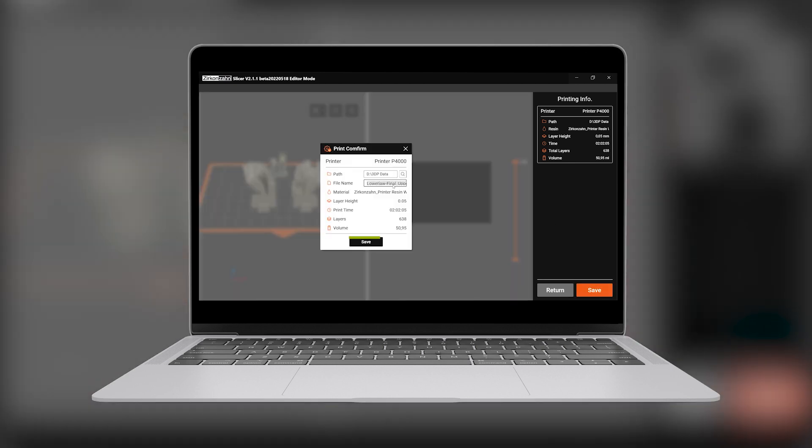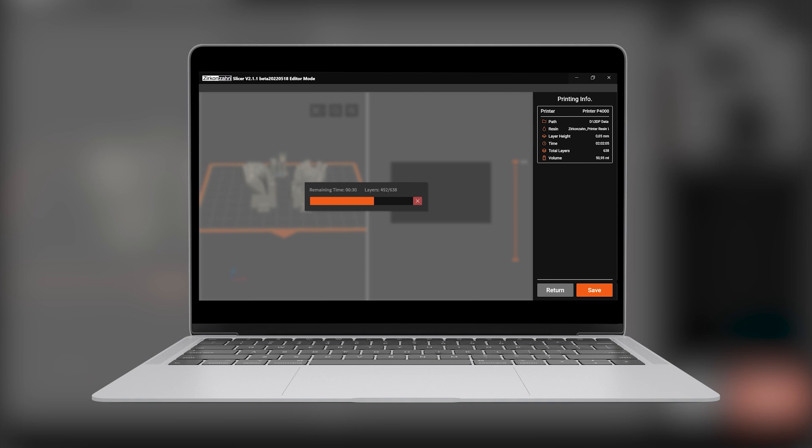Once the saving process in the slicer software is completed, you can send files directly to the printer by copying the IP address and clicking on upload.